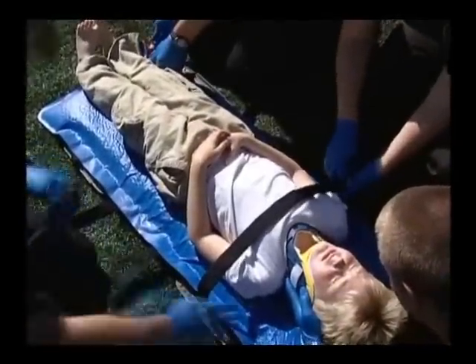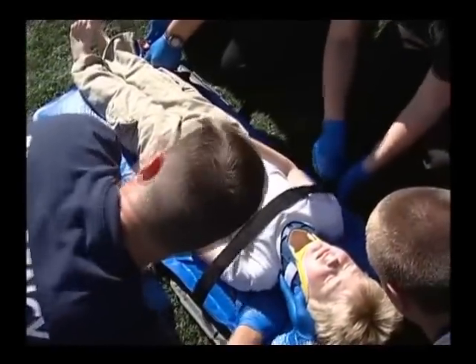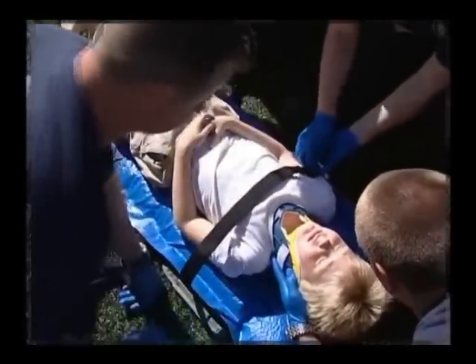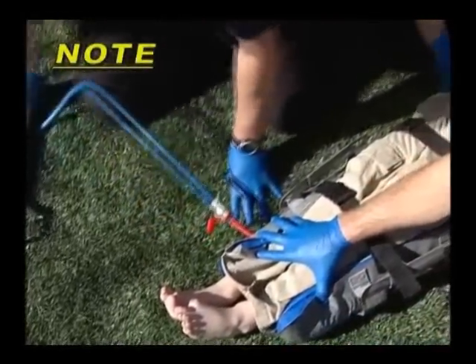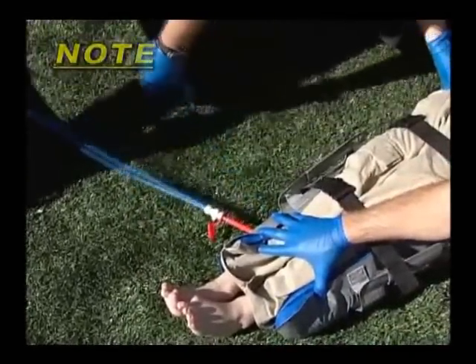The straps of the pediatric mattress come straight across the patient and do not zigzag down the patient. Note: the pediatric evacu-splint mattress only has one valve at the foot end of the mattress.